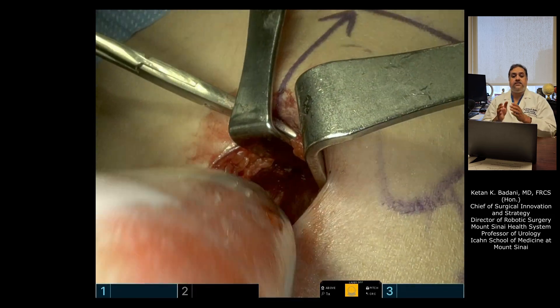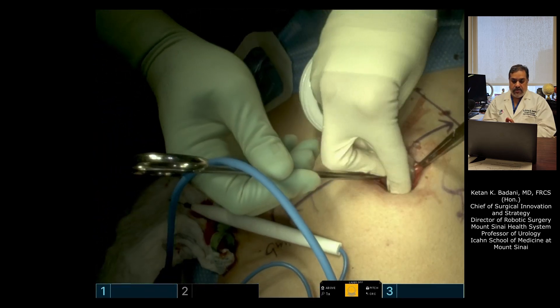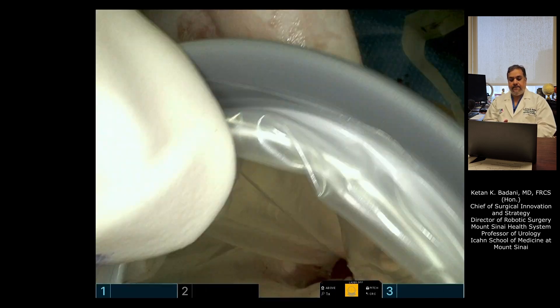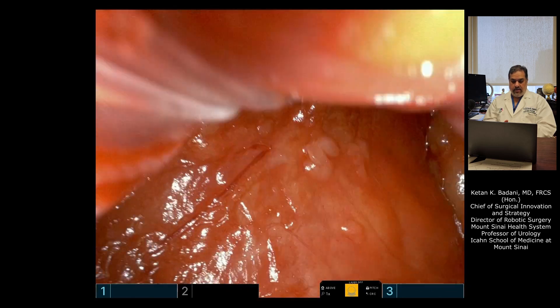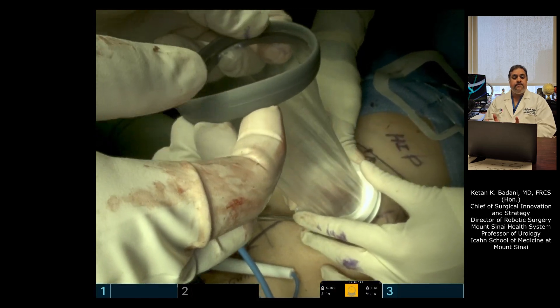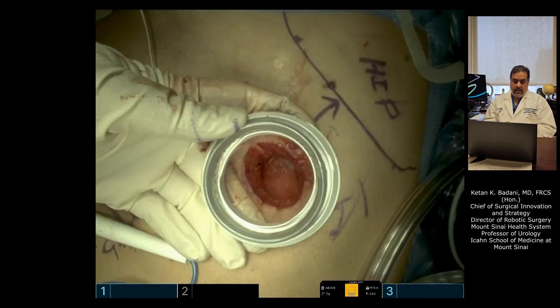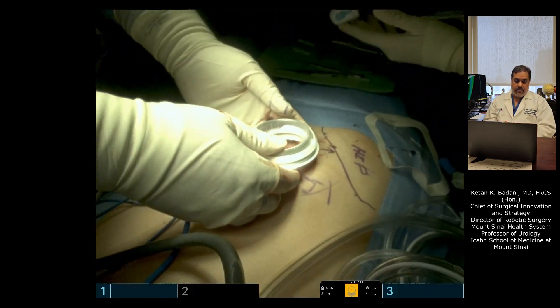That's enough space to now dock the single port system and do the operation. The internal ring of the access port is going into the space. We'll slide down the external ring. Let's take a quick look inside — that's retroperitoneal fat, so we know we're in the right space. Slide down the external ring and roll it down. This ring will keep the peritoneum to the side. That's the view — now we can dock the robot.